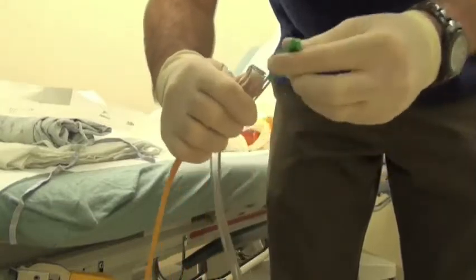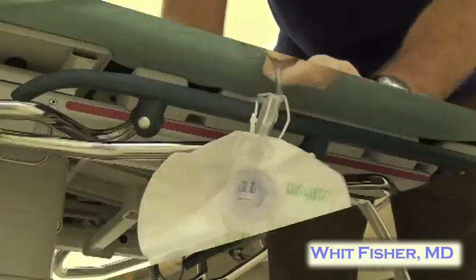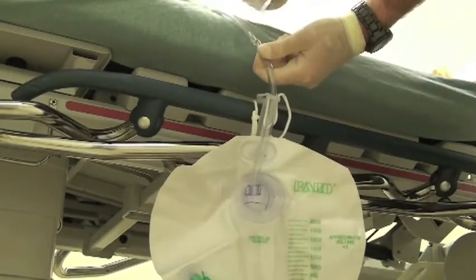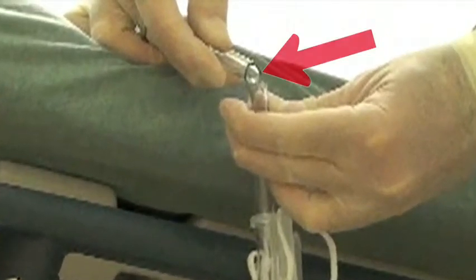You take a regular Foley kit and clamp the end near the catheter. Then take some sterile suture removal scissors and cut a hole in the plastic tubing not too far from the Foley collection bag.